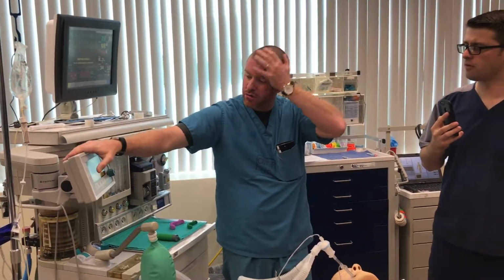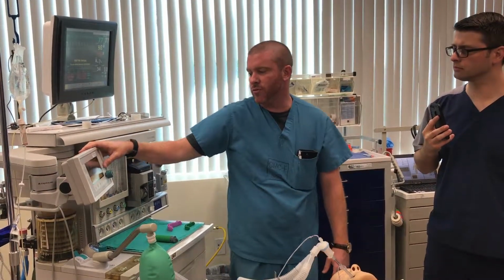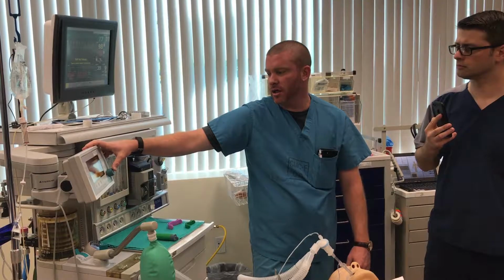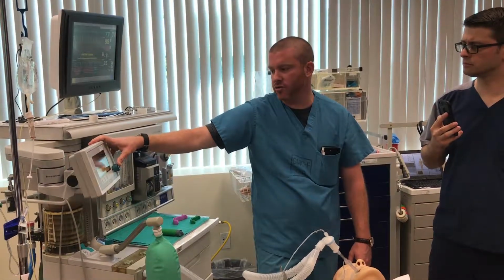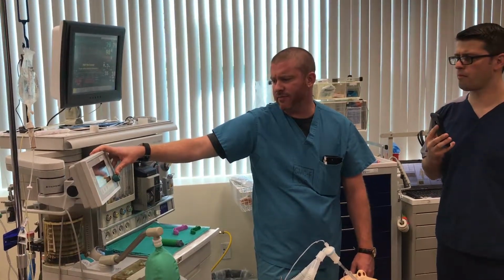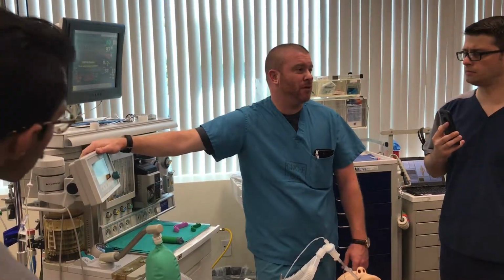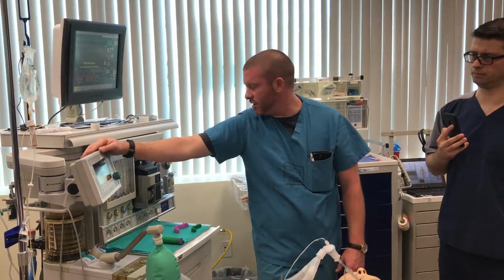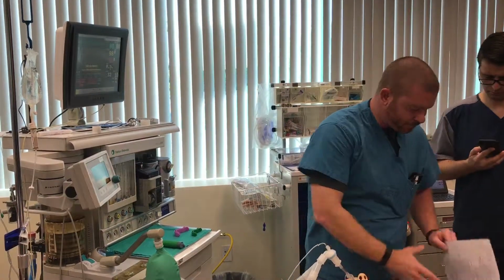So two things you can do, tidal volumes at 200 or less, or you can switch him over to pressure control. Okay, ventilation mode, there's volume control, I'm going to go to pressure control, and turn him down way low, to say, I'd turn him to 15. Okay. Pressure, I don't want to go above 15, or I would go to 200 cc tidal volumes. That's pretty much that. Does that make sense?